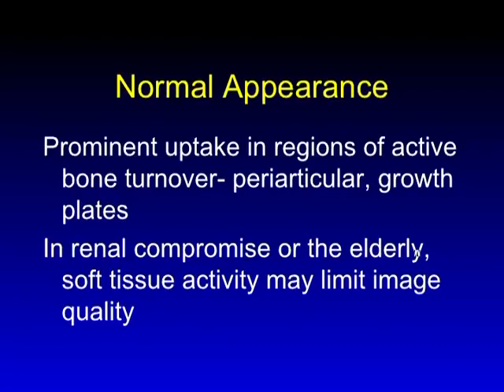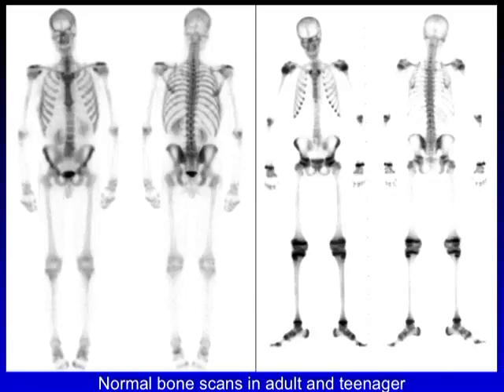The bone scan normally shows uptake proportional to bone turnover, and that defines the normal distribution. In patients with poor renal function, particularly acutely, you have more soft tissue uptake, which is why the bone scan in the elderly typically doesn't look so good. In children with very intense growth plate uptake, you also have very intense bone uptake. Here we have a typical appearance of both an adult and a teenager showing the physiologic differences.